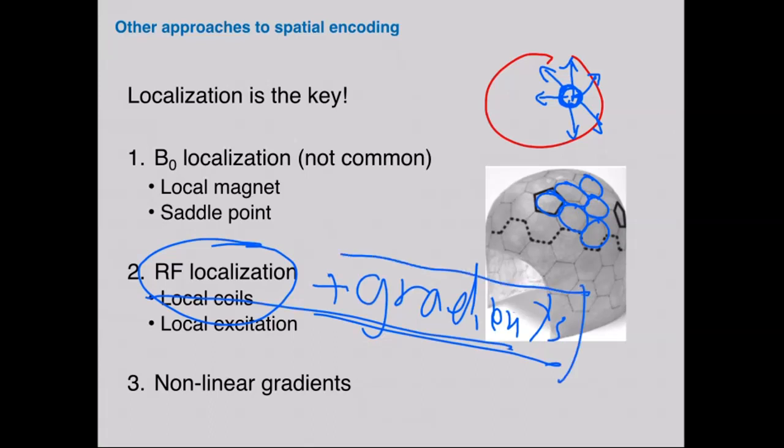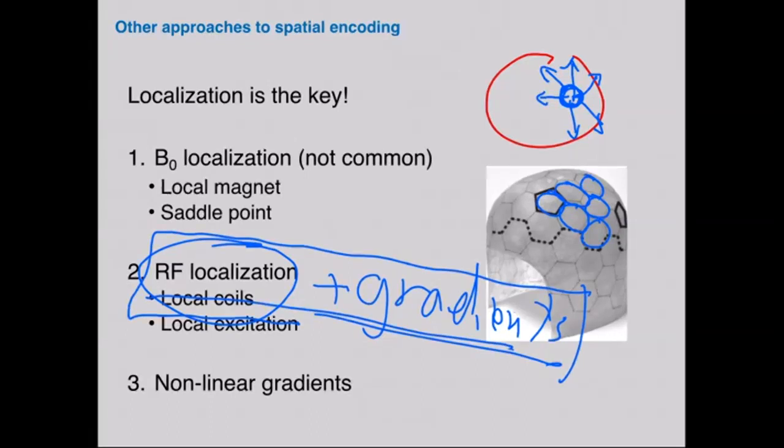And that's an advanced topic that we're going to talk about more later in the class: how you can leverage the fact that you're imaging with local coils as well as gradients in order to go beyond the typical Nyquist criteria, and collect data at a spacing that is much larger than 1 over the field of view, which traditionally would give you aliasing, but because you're using many local channels, you're able to solve the problem.